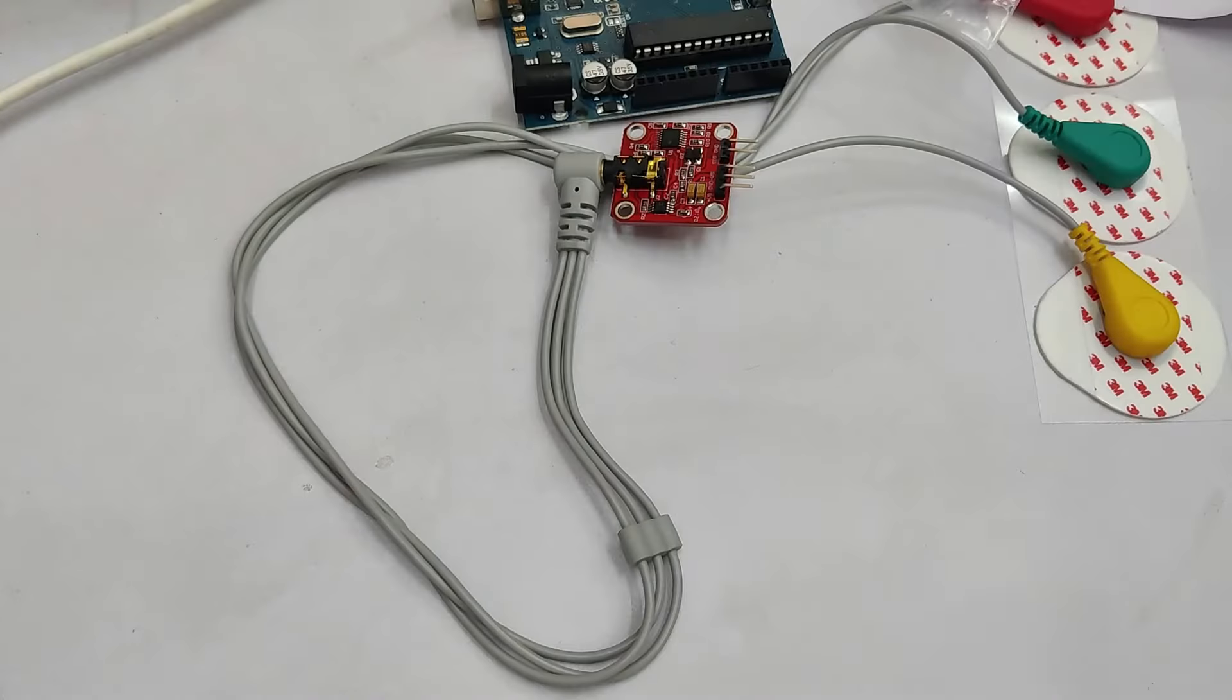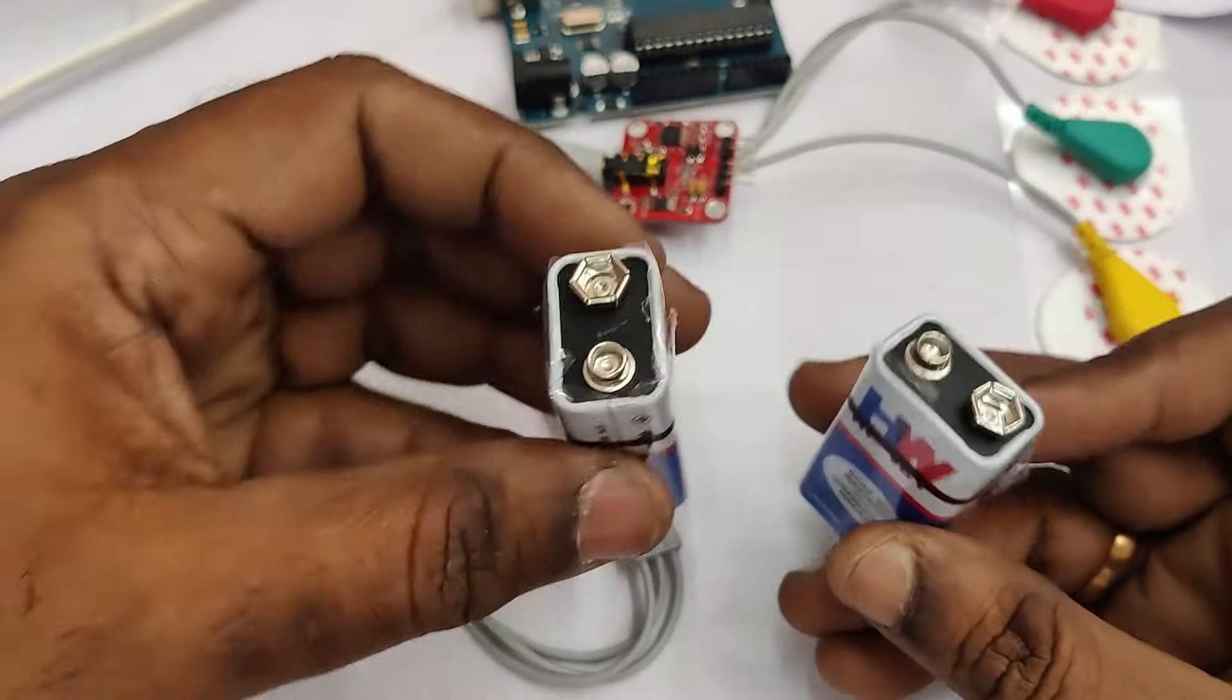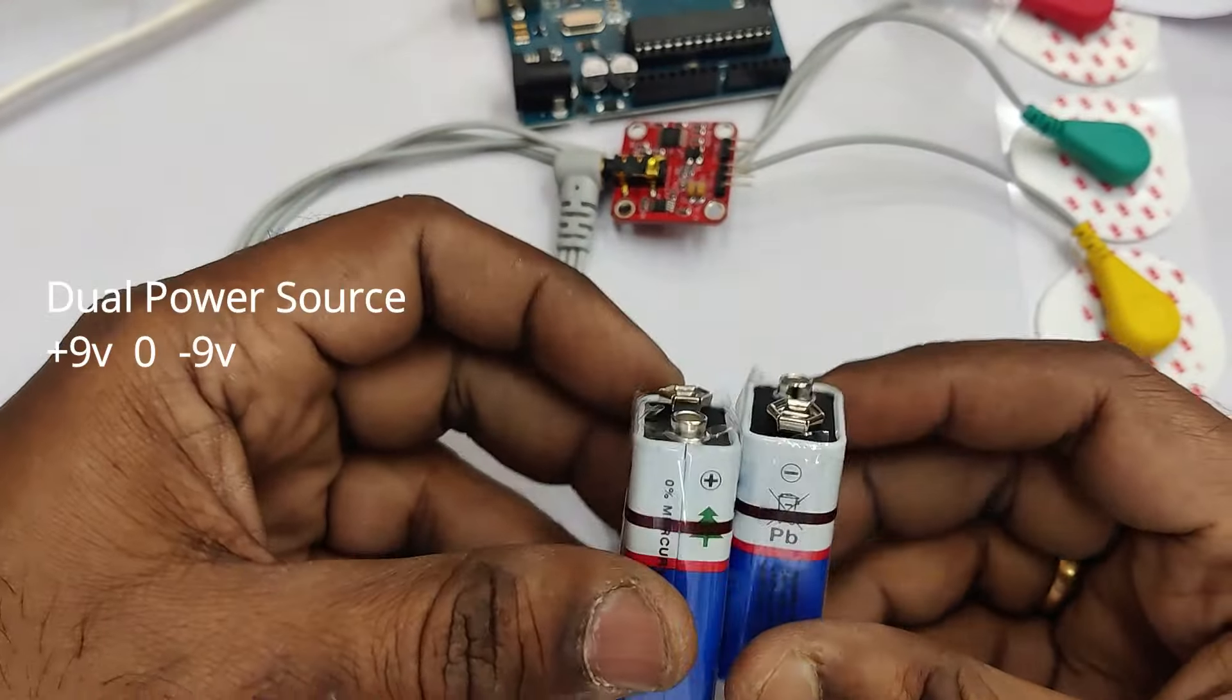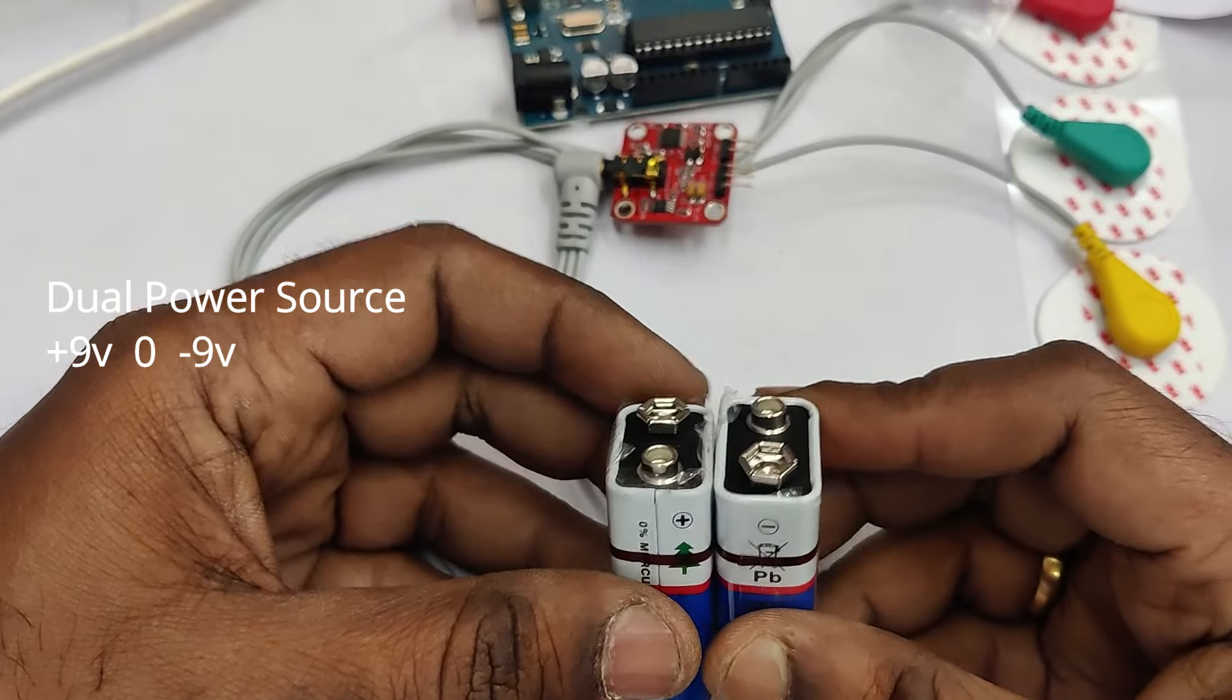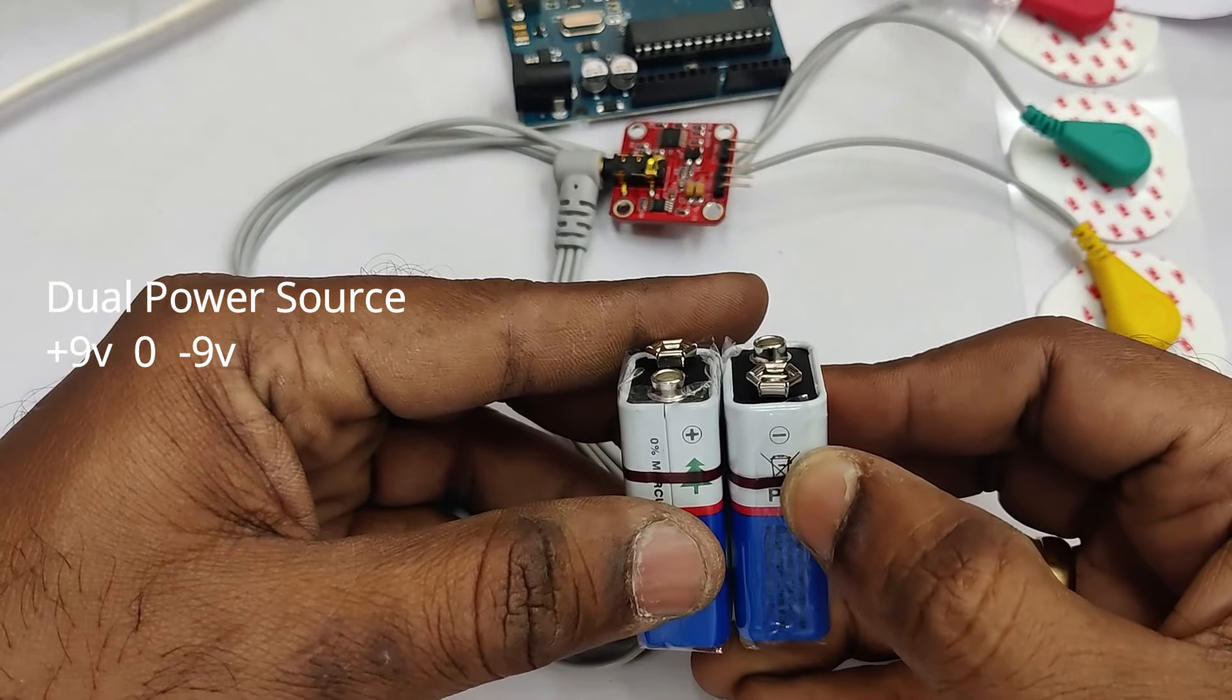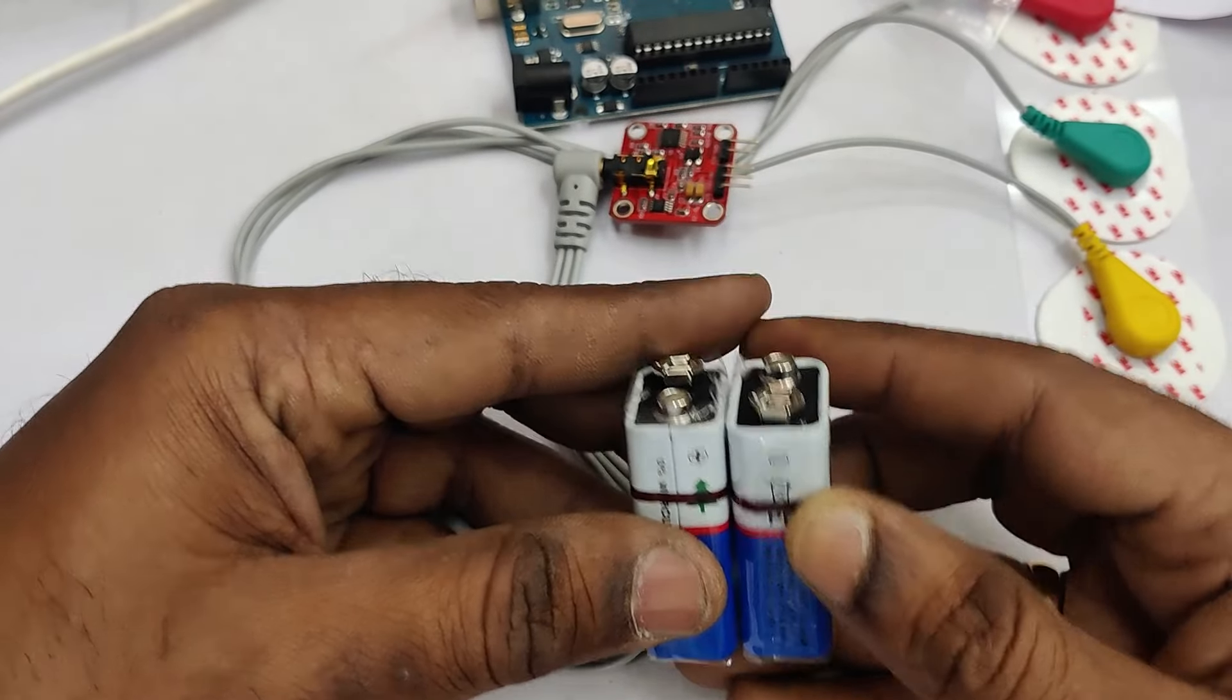Now let us see how to make the power source for this. You require two 9 volt batteries to produce plus 9, 0, and minus 9 volt.